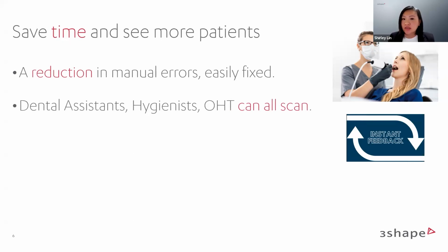Now, dental assistants, hygienists, OHTs can all scan. An intraoral scanner is essentially just a camera, so the use of the scanner can be done by practically anybody. There are no legal requirements for you to be a medical practitioner. A lot of practices that I've visited, and even myself, when I spent some time being a DA, I actually did all of the scans for my dentists.